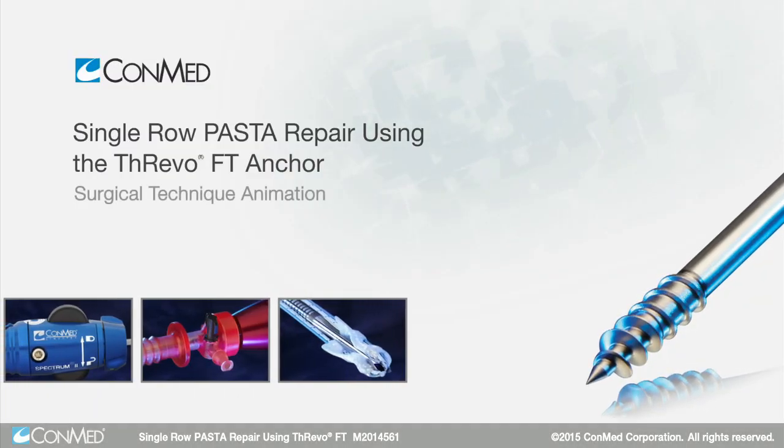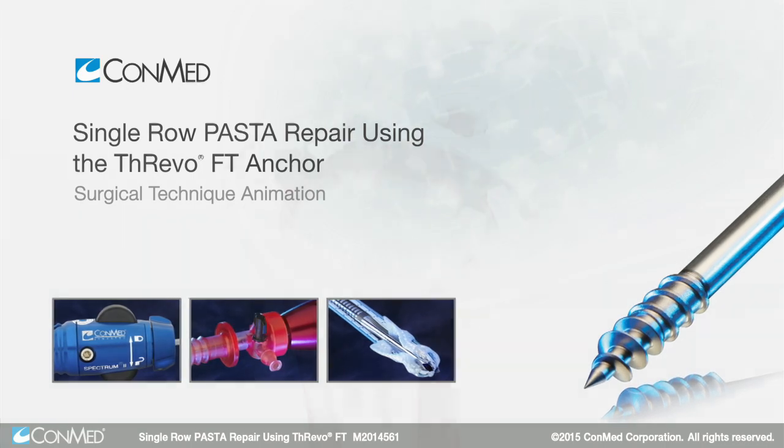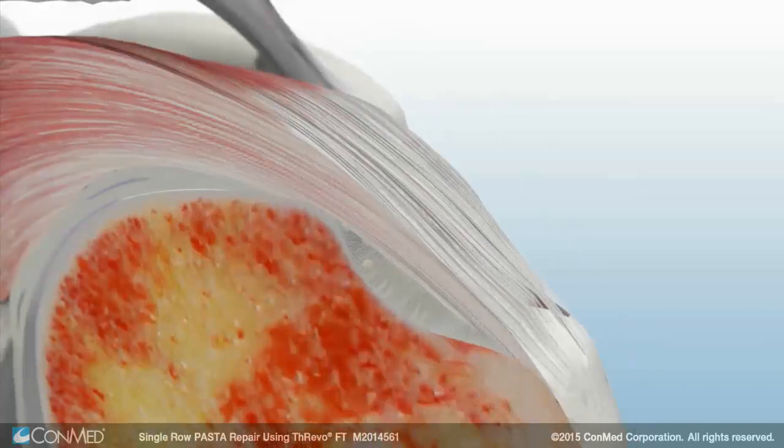Performing transtendinous repairs using the triple-loaded self-tapping ThRevo FT anchor and passing sutures with a spinal needle is a proven method of repairing a partial articular-sided tear.